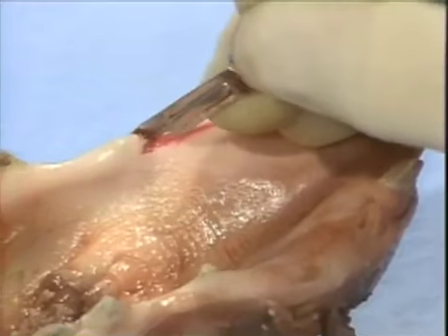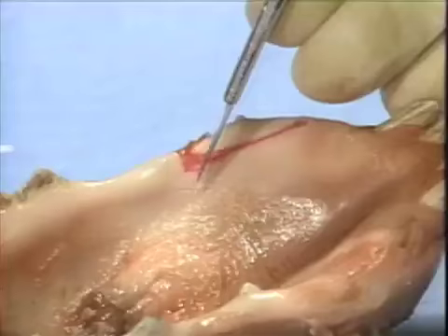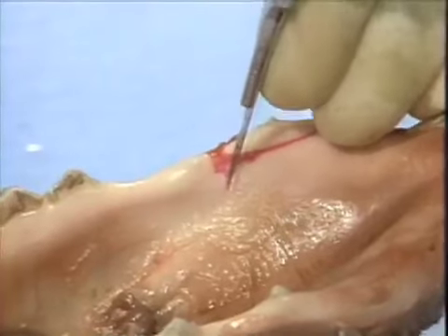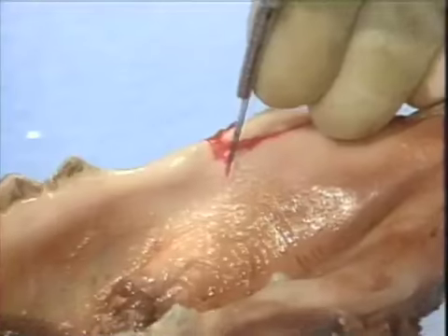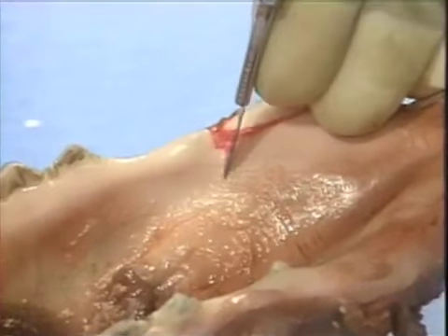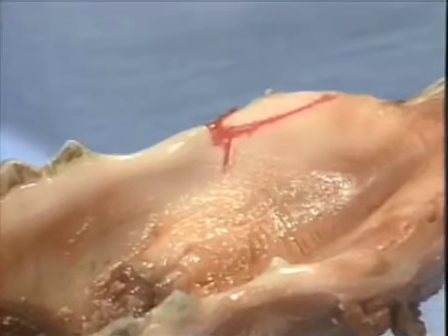We will also place vertical releasing incisions. In this case, the incisions will not be parallel, but will be oblique. The purpose of this flap is purely access and not repositioning of gingival tissues. The vertical releasing incision is placed beyond the mucogingival junction to take advantage of the elastic nature of mucosa.